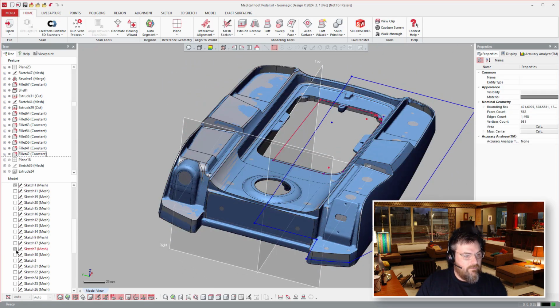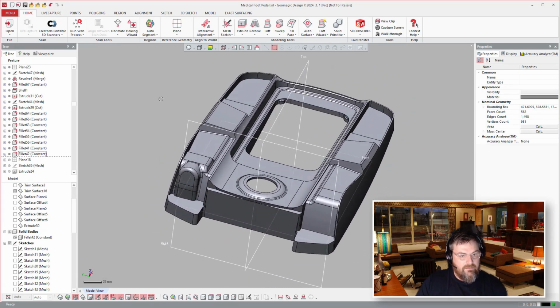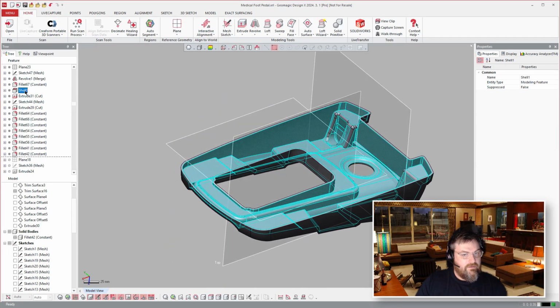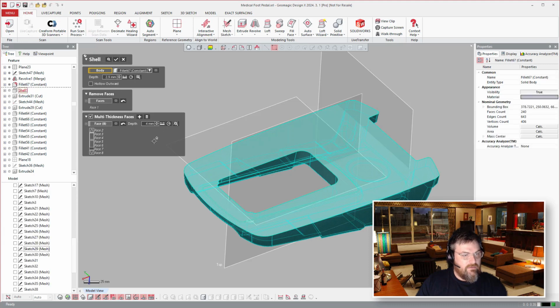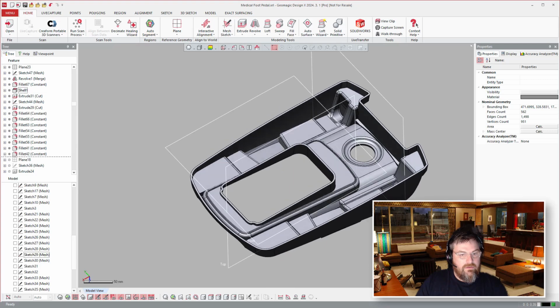Let's go ahead and do a little bit of cleanup here. Hide some of the sketches that I turned on before. So this is where we're at so far. And you'll notice that we did a shell. I went a little too far by clicking after all the fillets. But we did a shell of the opposite side here, and you can always click edit, and you can see here that we selected that face as the bottom when we did a 2.9 millimeter shell to it, and then hit OK, and it will actually recalculate it there. So now you see we have a nice beautiful shell.